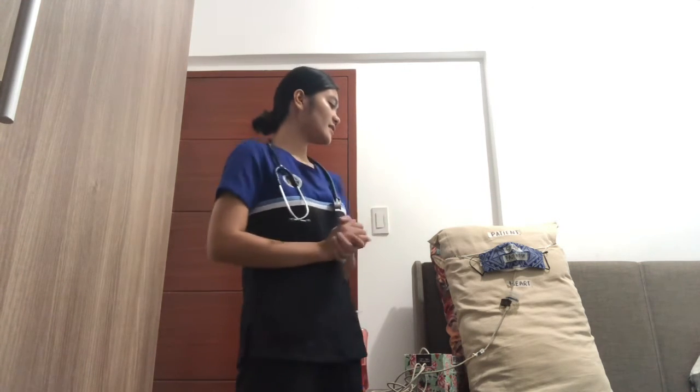Okay. After that, if you observe that the mist stops but there's still medication clinging in the side of the chamber, you can tap it and then the mist will start again.